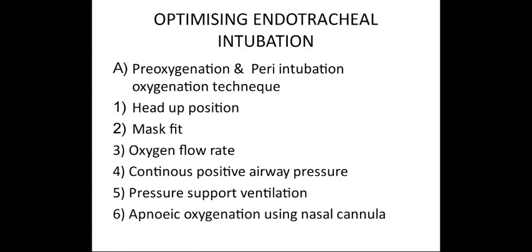Number 1, head-up position. Pre-oxygenation should be given using a 20-degree head-up position unless contraindicated. This position is more comfortable for the patient to take full breaths. In flat position, posterior portions of lungs are more prone to atelectasis and collapse. It reduces oxygen reserve, so it shortens safe apnea time.